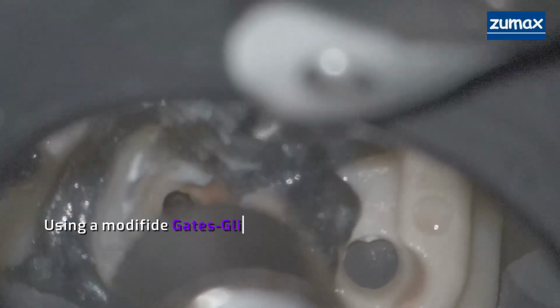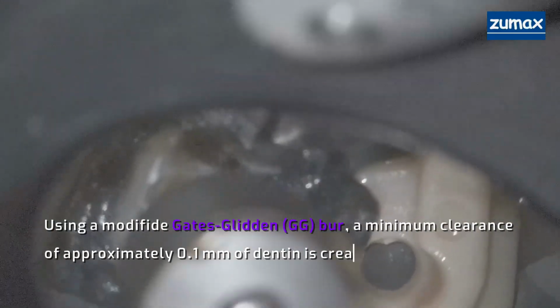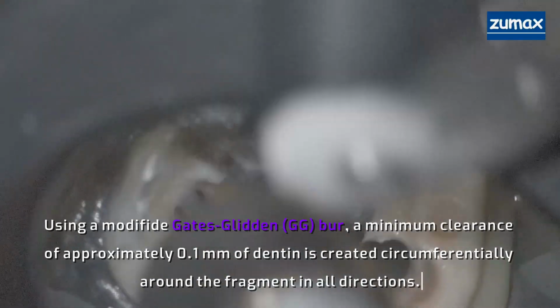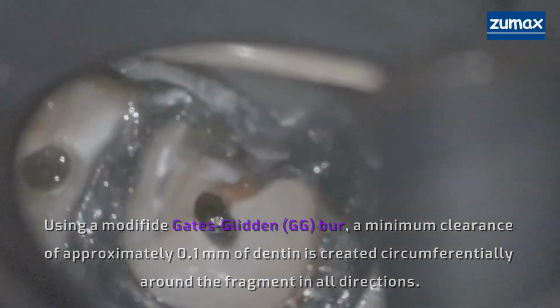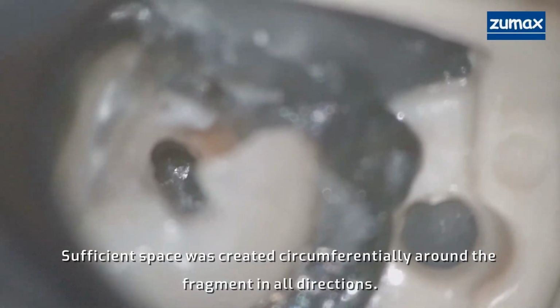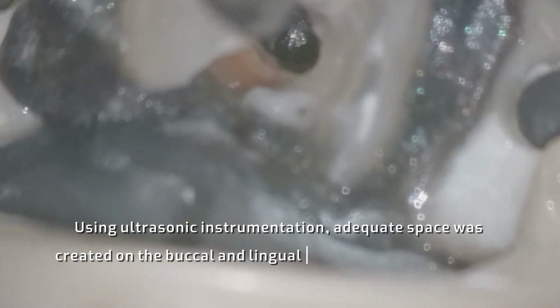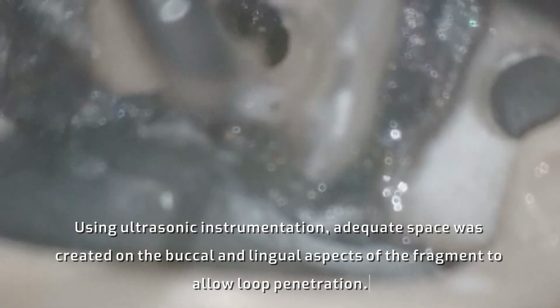Using a modified Gates Glidden (GG) burr, a minimum clearance of approximately 0.1 mm of dentin is created circumferentially around the fragment in all directions. Sufficient space was created circumferentially around the fragment in all directions. Using ultrasonic instrumentation, adequate space was created on the buccal and lingual aspects of the fragment to allow loop penetration.